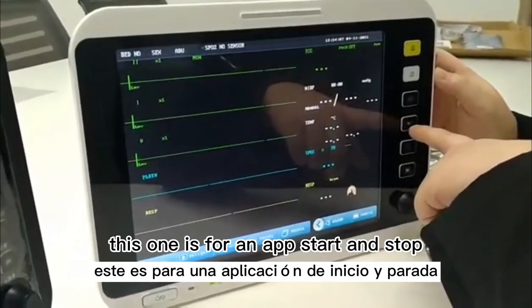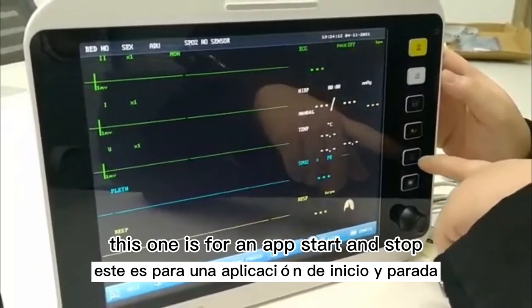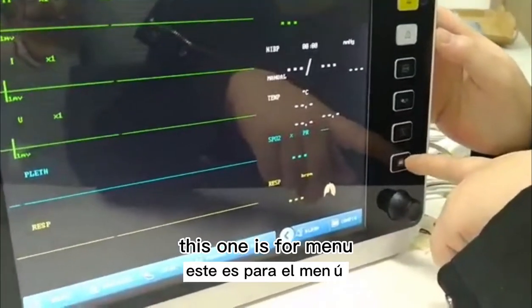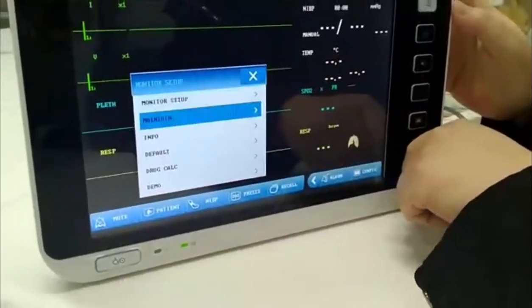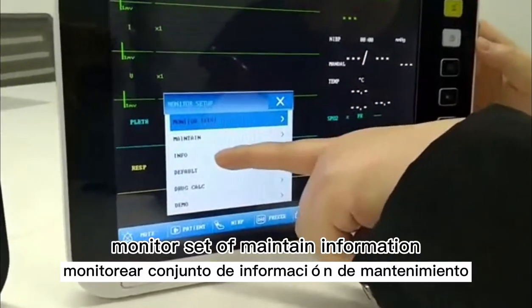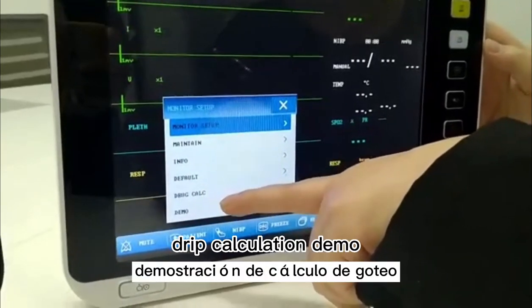This one is for NIBP start and stop. This is for recording. And finally, this one is for the menu — user menu and settings. There are some menus inside: monitor setup, maintain, information, default, drug calculation, and demo.